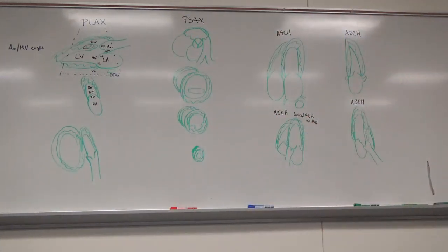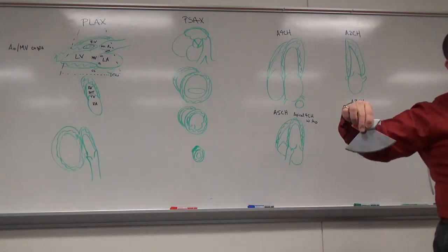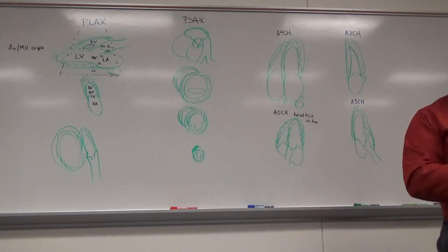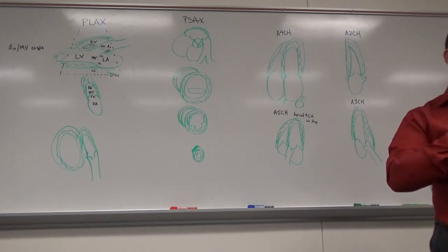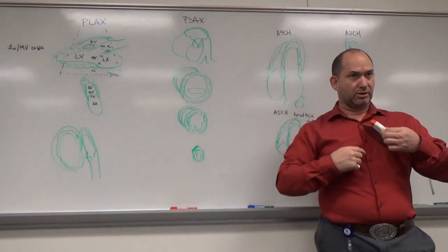So that's tricuspid valve. How do we find the tricuspid valve from our parasternal long axis view? By sweeping again like a broom, you're fanning the sector, kind of like this. So this is our handy little thing. So if you want to get one of these and paint a side of it, this is your indicator side. This is our transducer. We're about rib space 3. So we're angled like this.